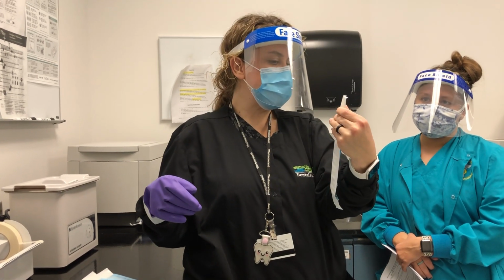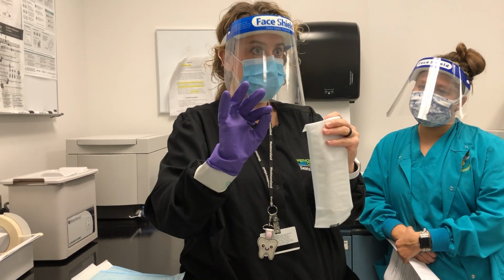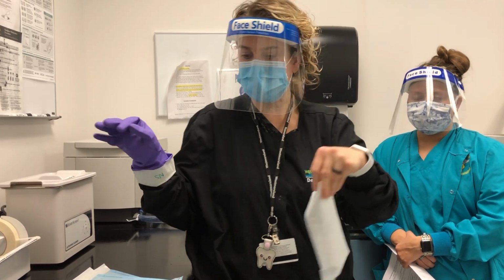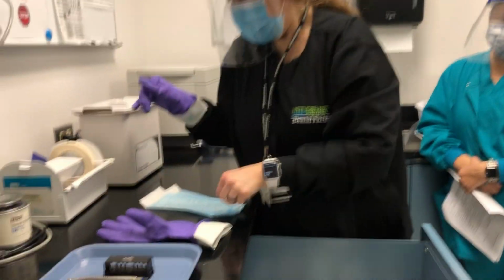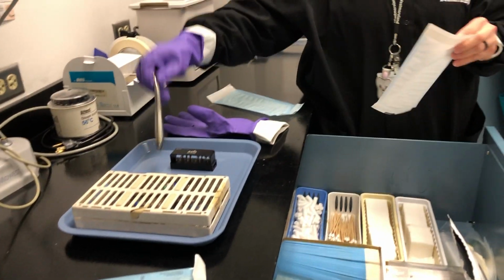For practice purposes, this is a peel and stick, which is really nice. You just peel the sticker and fold it shut. For today's purposes, I'm just gonna have you fold it over, okay? Because we're gonna reuse these. So we're doing one for the syringe. We're doing one for the handpiece.